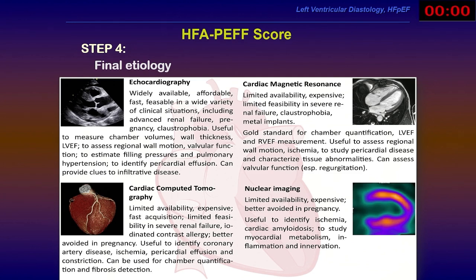If you get your patient, have the figures I told you about before, that you reach the figure 15 for the E and E prime. But can I take?